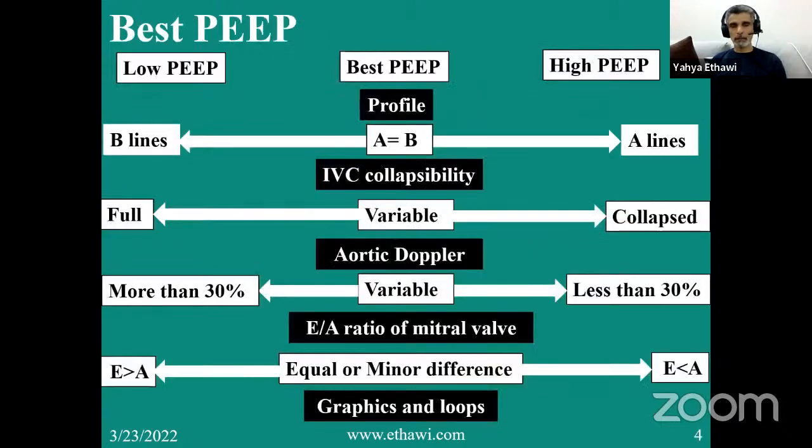And I don't know if you guys practice ventilation, but I do what they call best PEEP. For me, the best PEEP is a dynamic PEEP, so it's a range between numbers. So I say the best PEEP for this baby, let's say, is between 6 and 8, and that's where the registrars and the nurses can play with it.